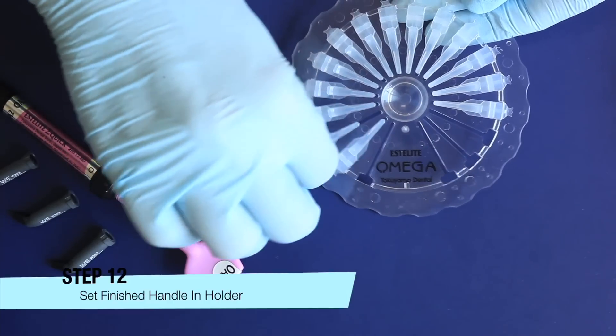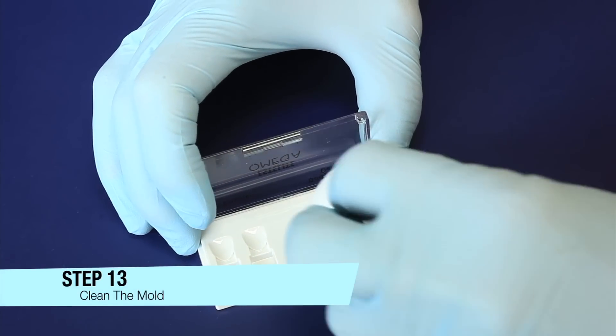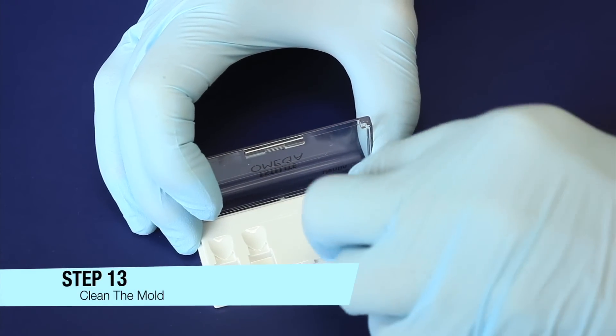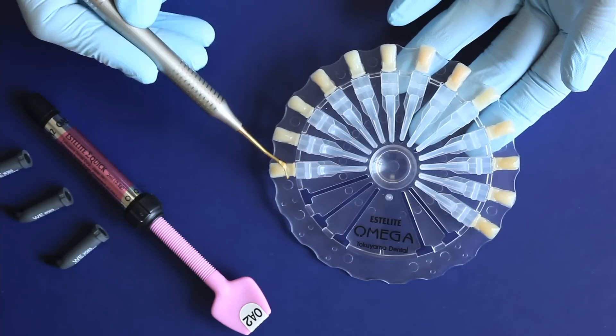Step 12: Set the finished handle in the holder. Step 13: To remove excess residue after each use, clean the mold with an alcohol-moist two-by-two. Repeat the above steps for all desired shades.